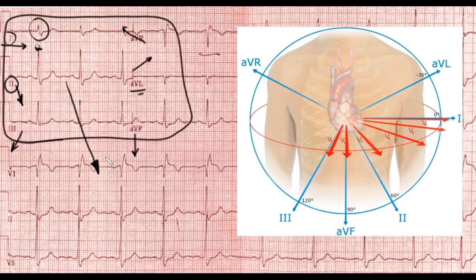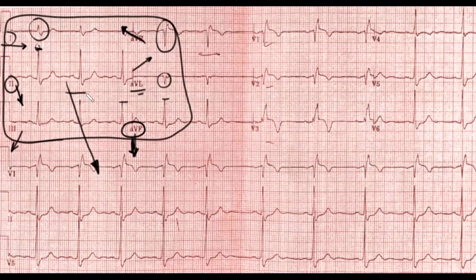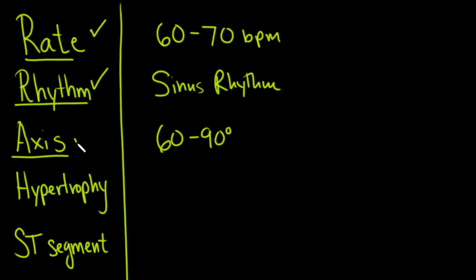Given that, the axis should be positive in lead III — and it is — and positive in AVF since it runs nearly parallel — and it is. It should be negative in AVL since it's going almost opposite — and it is. So the overall axis is somewhere between 60 and 90 degrees. That takes care of axis.